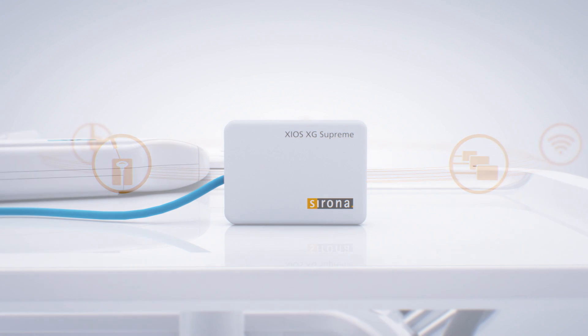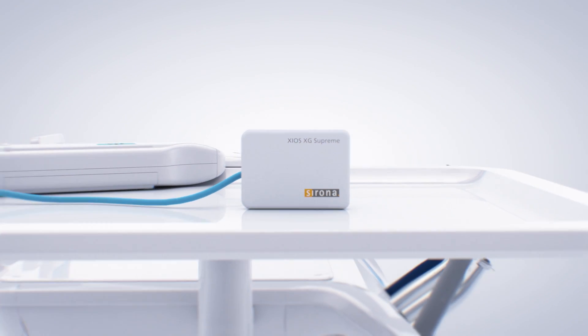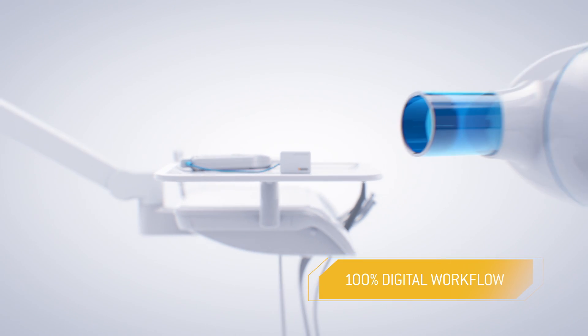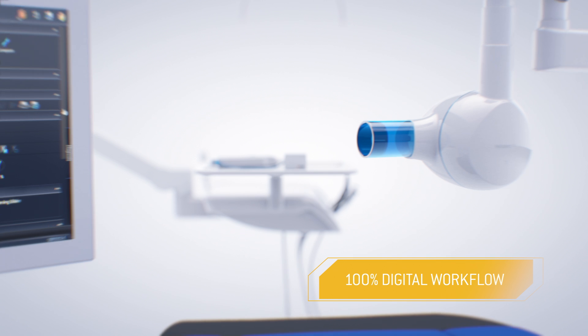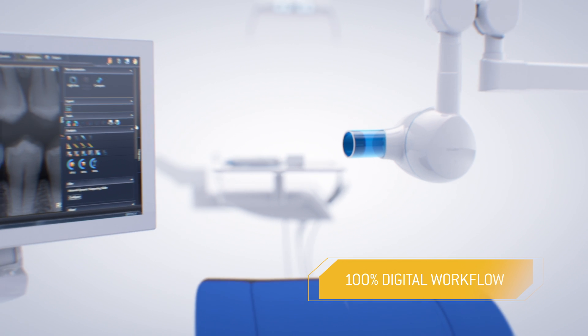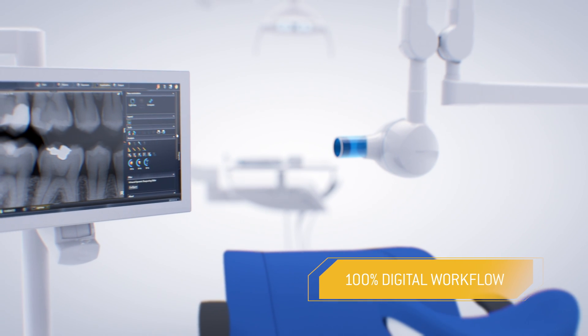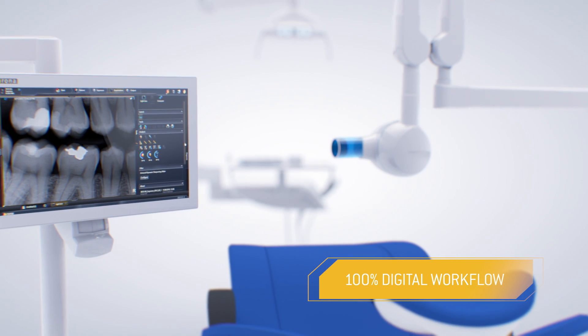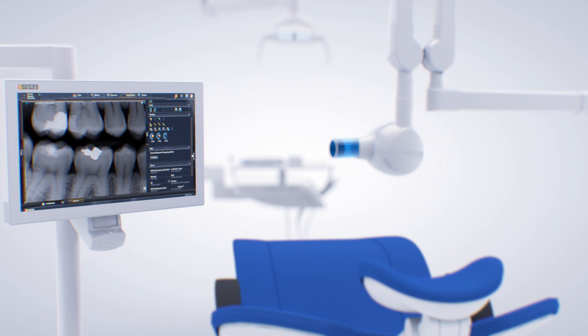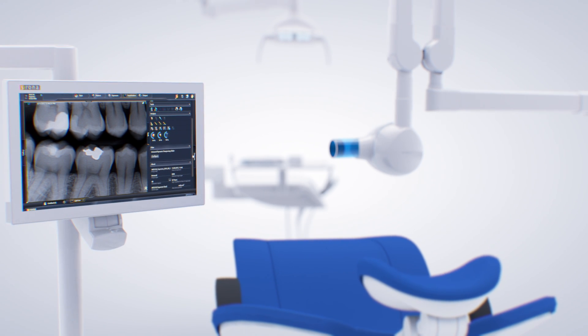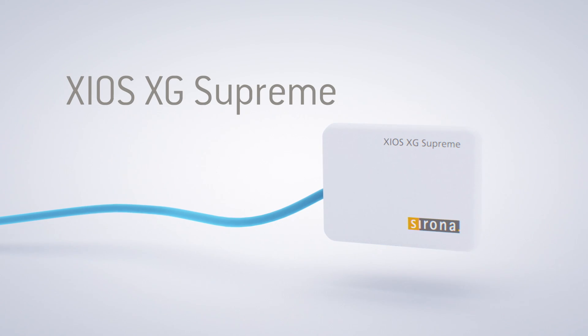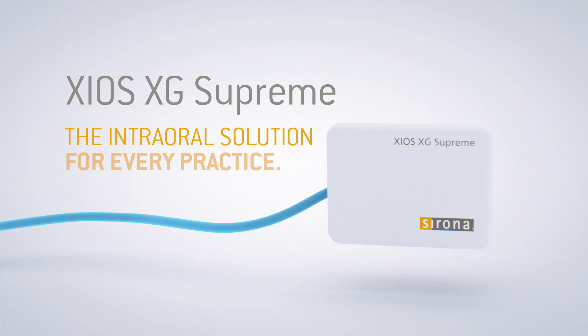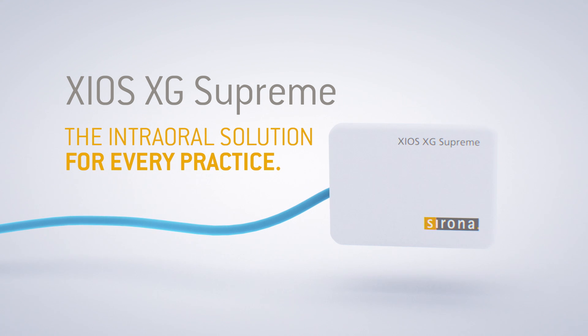Enjoy all of the benefits of innovative digital solutions from Sirona with the XIOS XG Supreme sensors and the intraoral X-ray family. XIOS XG Supreme, the intraoral solution for every practice.